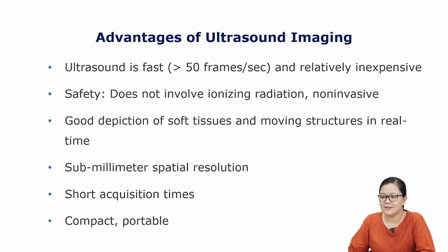Also, ultrasound is relatively inexpensive compared to the other imaging modalities. It's also safe because it does not involve ionizing radiation and it doesn't require you to cut open a patient to look into it, so it's fairly non-invasive. And ultrasound is pretty good at depicting soft tissue structures, especially with moving structures.